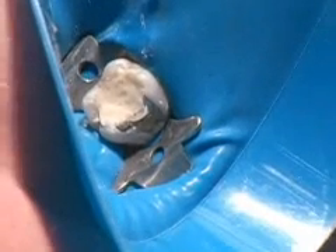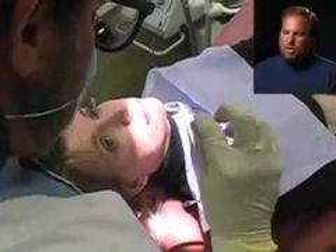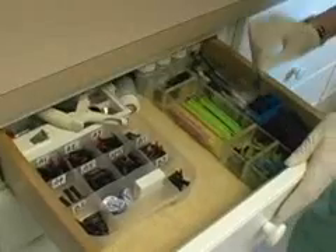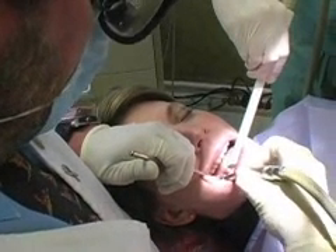We place that over top and it sets quickly. You can still see there's a silver filling in there over top — the root canal is done. The post is buried underneath that white filling that I just placed and am smoothing off. At that point the root canal and the post are done — a procedure that would have taken three visits and hours 10 to 12 years ago took 40 minutes. This tooth will still need a crown, but it will be stable for several weeks or a month while everything heals. We'll have her bite to make sure everything's comfortable, and the assistant will use articulating paper to check the bite so the tooth isn't sensitive.